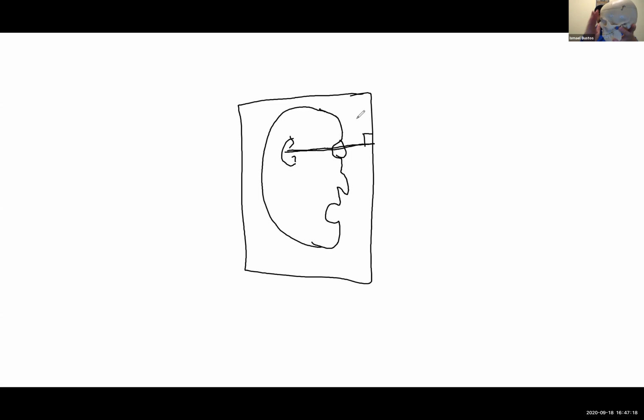So that OML needs to be perpendicular to that front edge of the image receptor, right? Even though we know the image receptor is on the back. Here's the front edge, so it needs to be perpendicular to that front edge. If I have my image receptor behind and I bring the edge out to become a plane, that OML is going to be perpendicular to that front edge. All right, so that's another thing.